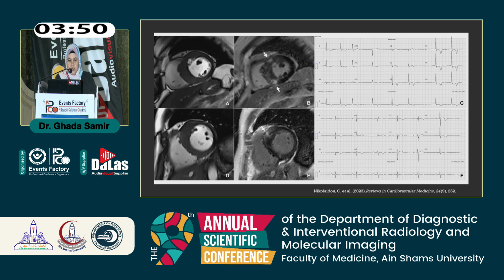And also MRI is important in detection of the pattern of LGE in such patients, like patchy and mid-wall enhancement, mainly at the RV insertion points. For example, this patient also has a first-degree AV block, and the MRI shows an anteroseptal wall hypertrophy with patchy fibrosis at the anterior right ventricular insertion.